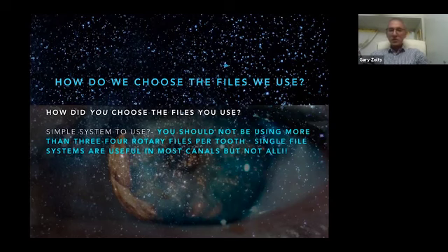Single file systems are useful in most canals, but not all. And I think that's important for all of us to recognize and to remember that a canal is not cylindrical. Even if we work to a large size tip file, there's going to be parts of the canal that are going to be uncleaned. And with a single file system, you're just not going to clean those areas. And that's what leads to failure.